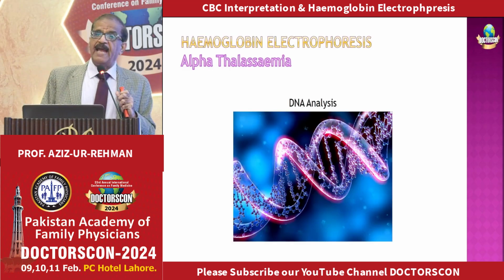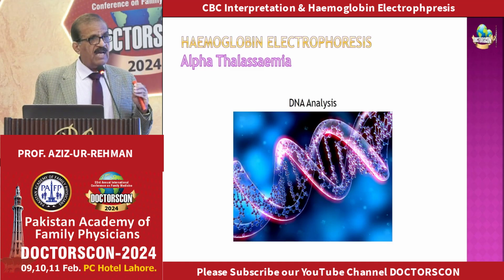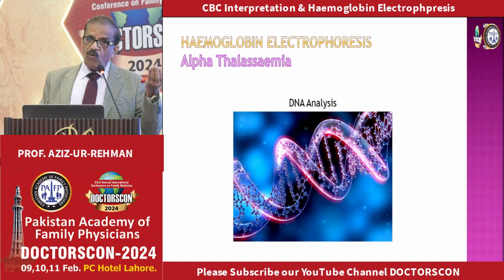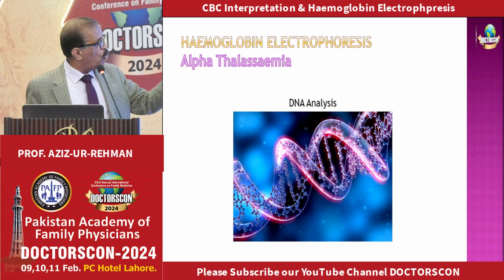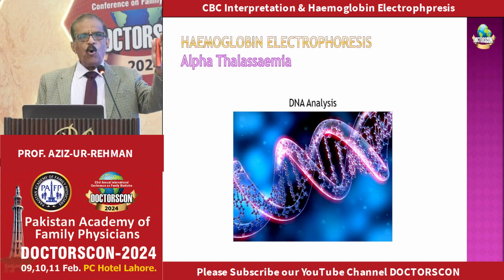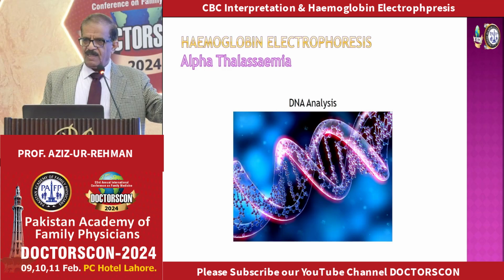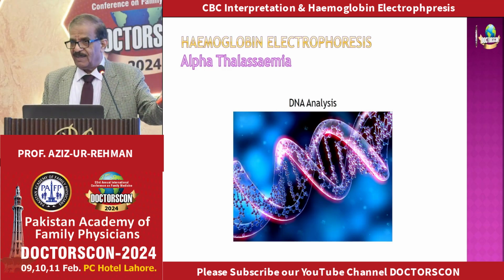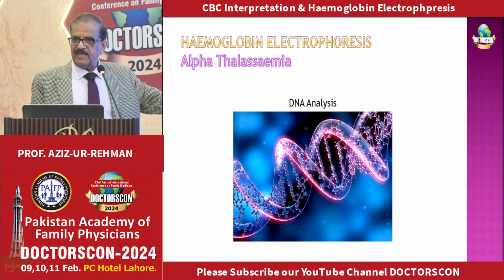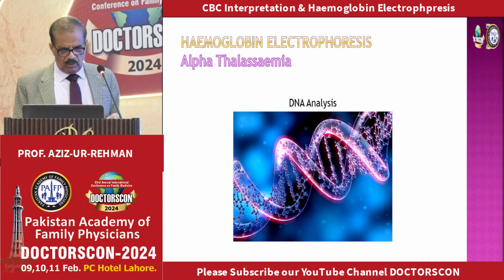That cannot be applied to alpha thalassemia, because in alpha thalassemia, the alpha chain cannot be replaced by another chain. So all will be reduced, and then you will have to go to DNA analysis. So what I practice is: hypochromic microcytic anemia, rule out iron deficiency, then rule out beta thalassemia, then you are left with the diagnosis of alpha thalassemia without going for a DNA test, because the other two important differentials you have already ruled out.